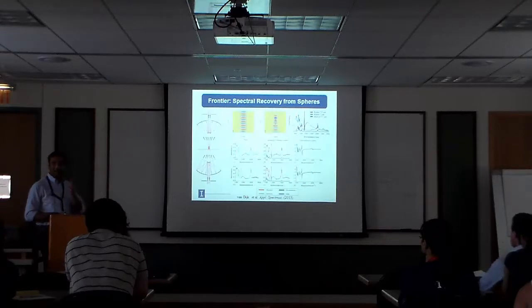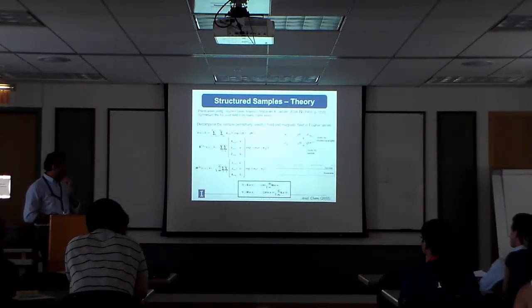For more complicated structures, one has to think of other ways to do it, which is still undergoing some ideas in the lab. The way we've tackled this, just to give you an idea of the complexity of the problem: the way you make your focus in the microscope is you take a plane wave and you add it up in the angular frequency. So that's one frequency. But the wave number frequencies, or the spectral frequencies, are independent of each other, so you consider one frequency at a time. So that's your second frequency.